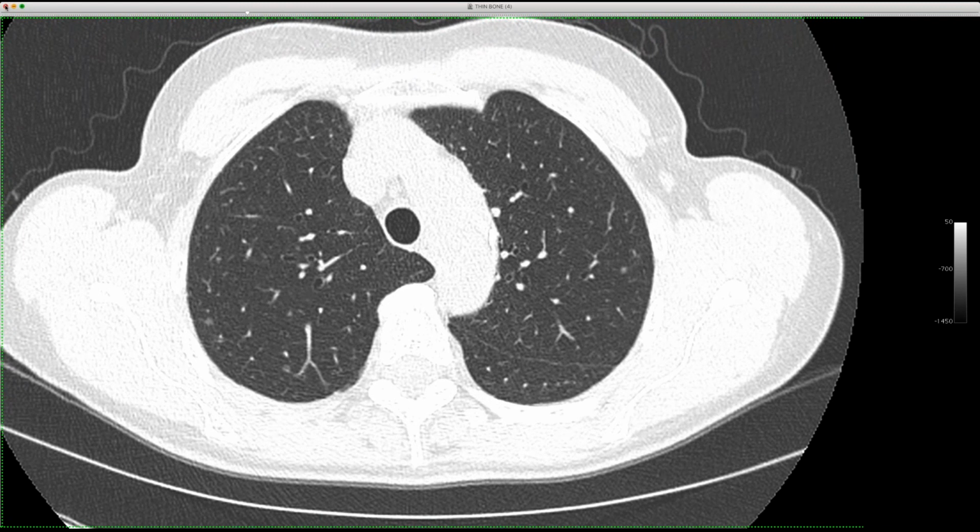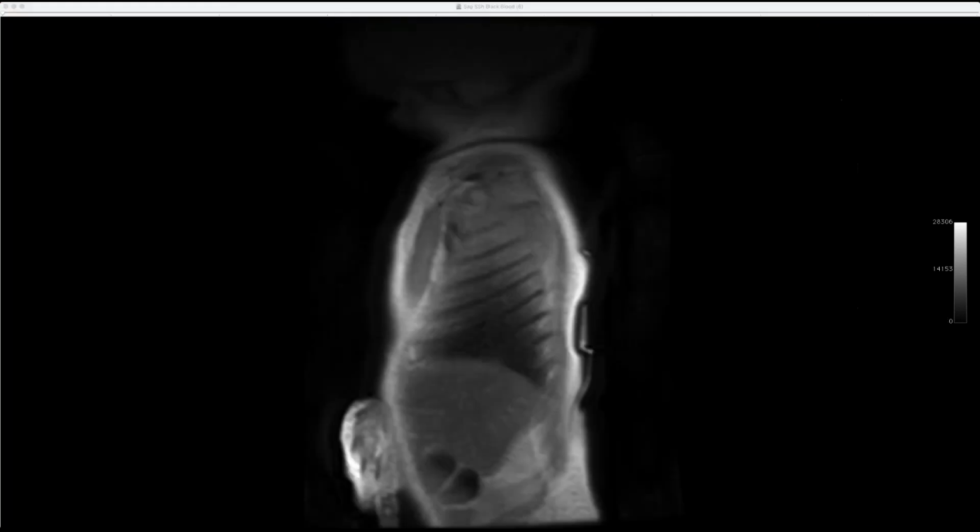So Jeff, what if there were air trapping along with this? Then you'd think about DIPNECH. Right. Although I have to say, the cases of DIPNECH I've seen don't have that many nodules, and the nodules are usually well defined because they're carcinoids. But it is a good point. She was 69. Yeah, she's a good age for it. So, okay. But you didn't have expiration, you didn't have a test for air trapping. We were doing it for nodule follow-up.